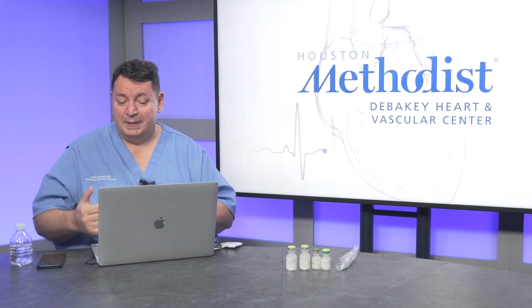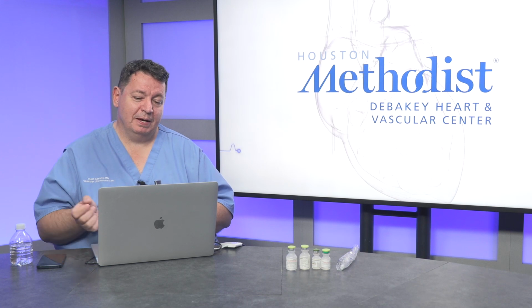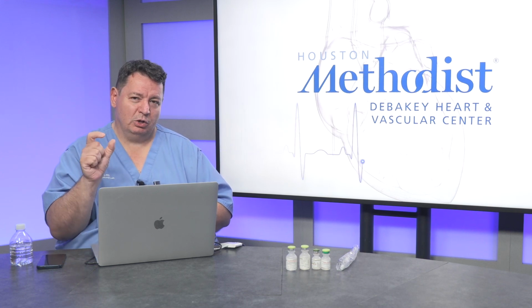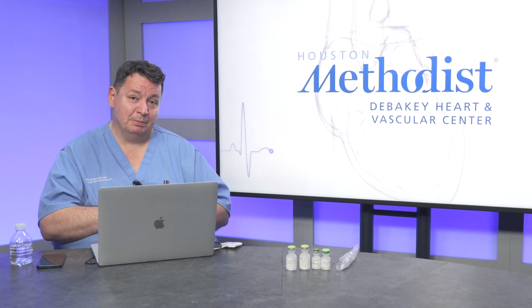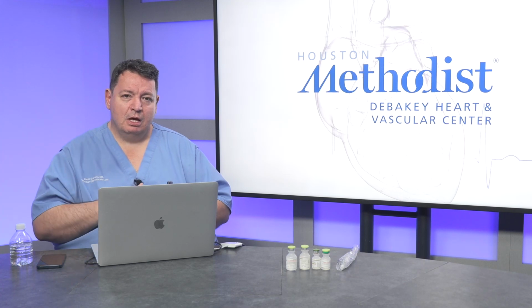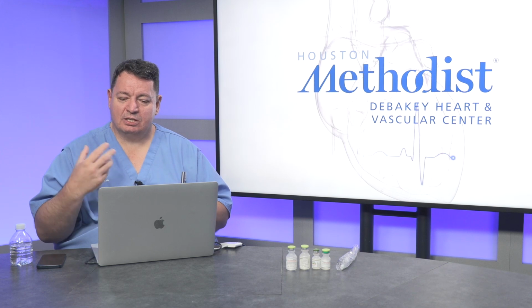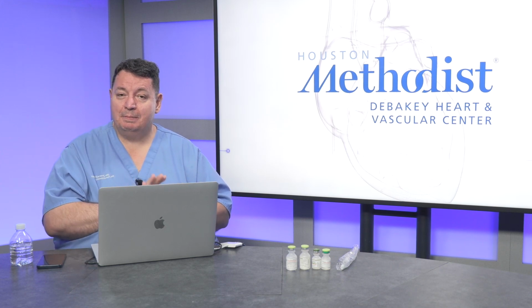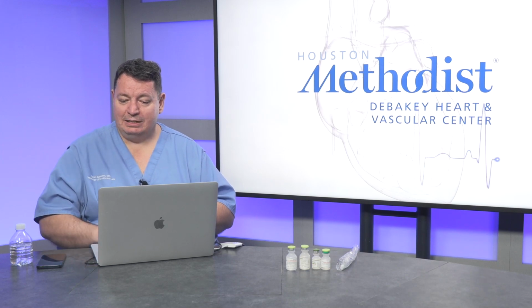I will show you. But why I think there's a physics pathway there too, that one of my physicist friends told me that the 2 megahertz, when your lower side is able to detect bubbles better. When you have a duplex 5, 7, suddenly those are not ideal for microembolus detection. So again, something with the physics. So this is why my 2 megahertz is probably the best way to detect it. So back to the bubbles.